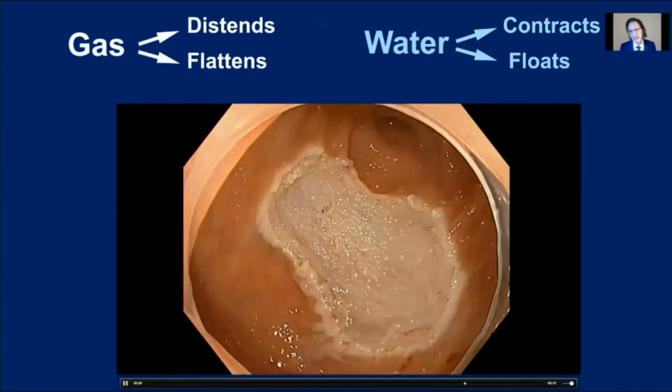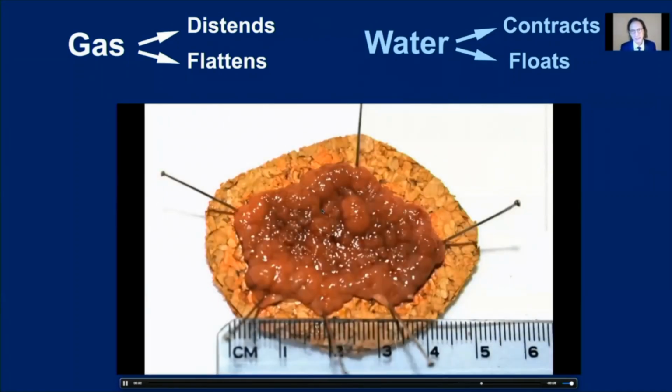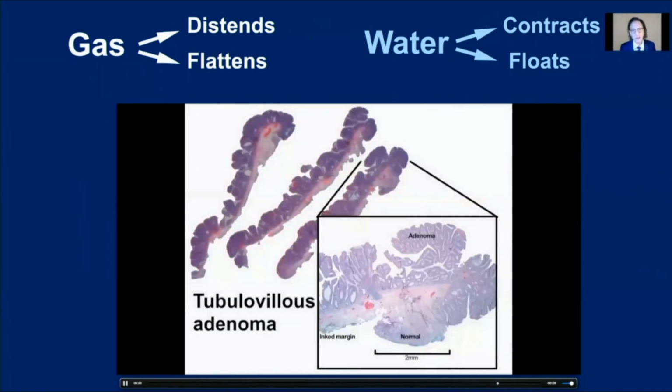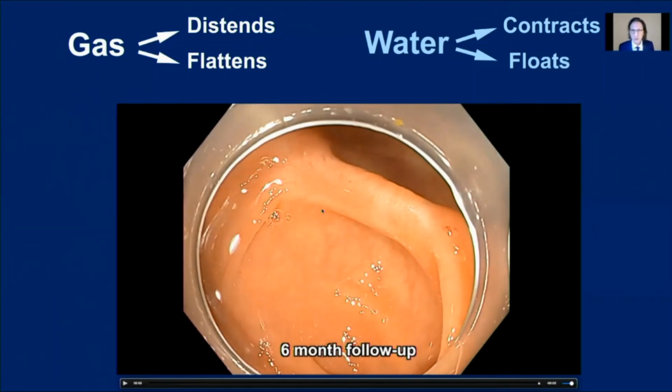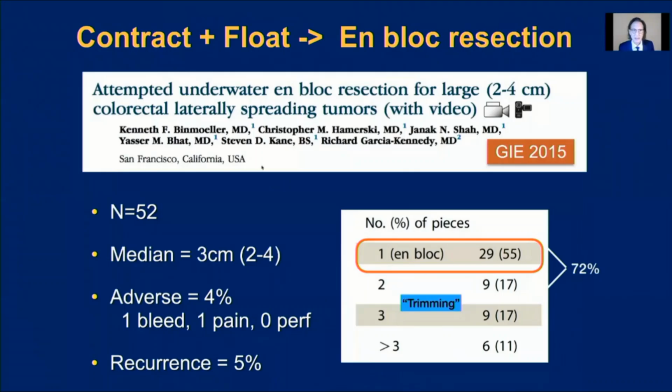So it's in that layer between SM1 and SM3, and SM1 and 3 are the layers that have the blood vessels. So that is why we often do not have any bleeding after underwater resection. So this contraction and floating effect is what enables en-bloc resection.